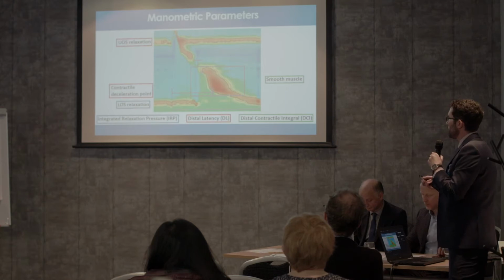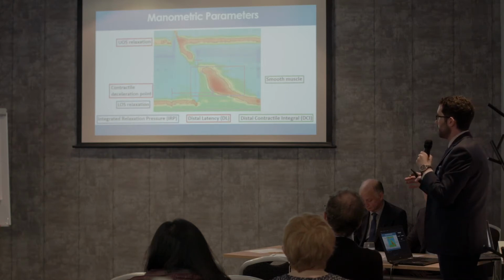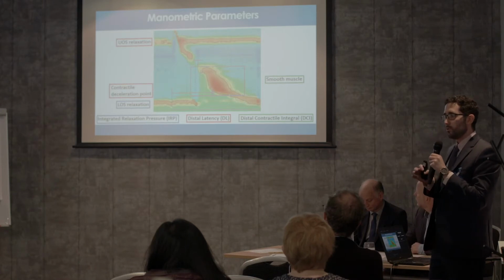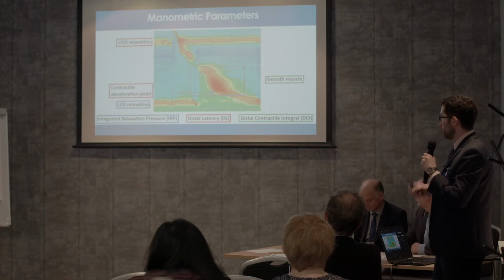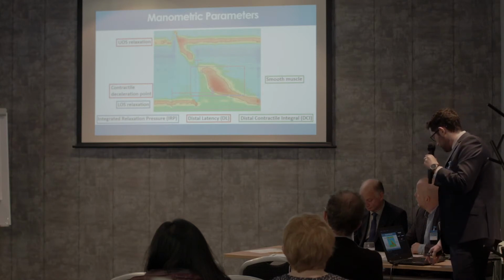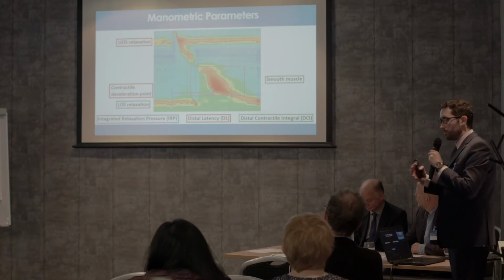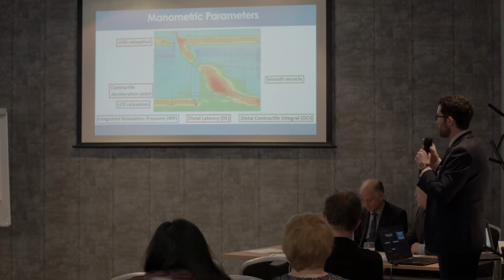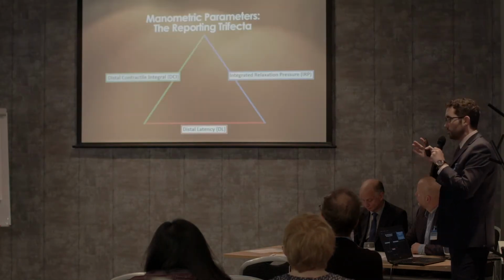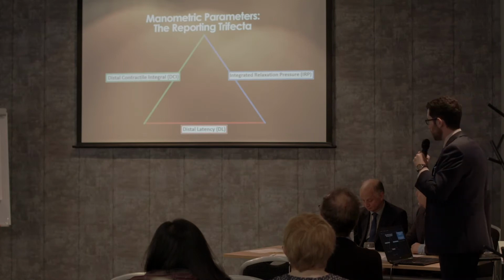There are a few other parameters that you can look at, but these three are key, and we would say that you need to make sure you're accurately measuring all three of those parameters for every single one of the wet swallows that you're taking. Just to drive that home, this is the end of the first part of the talk, which is just on the basics of HRM. Always make sure that you're accurately measuring these three parameters.